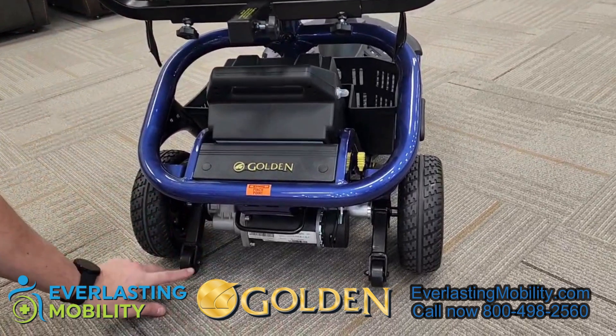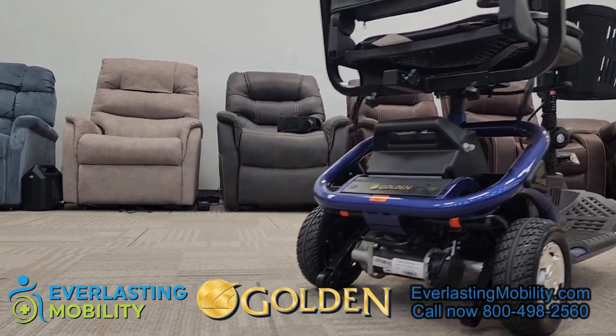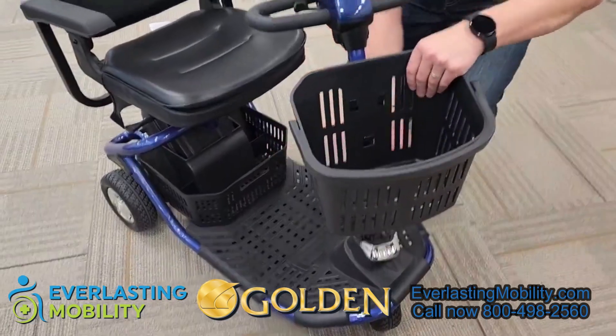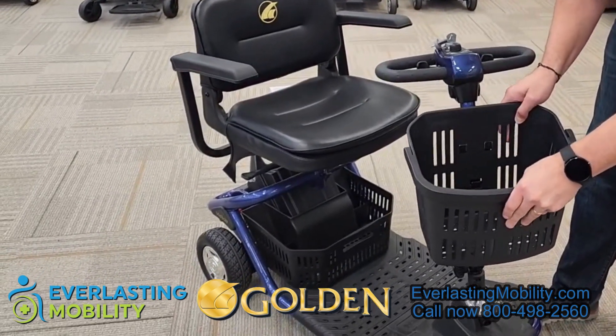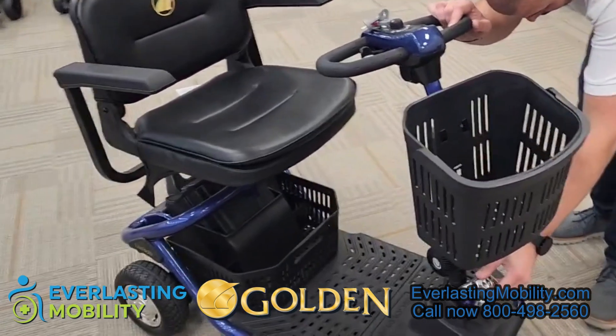On the back, these are anti-tip wheels — another safety feature so if you're going up an incline you don't have to worry about the scooter tipping backwards. There's a lot of additional storage in the basket underneath the seat, and then of course there's a large storage basket with a handle so you can pop that off easily and put it right back on.